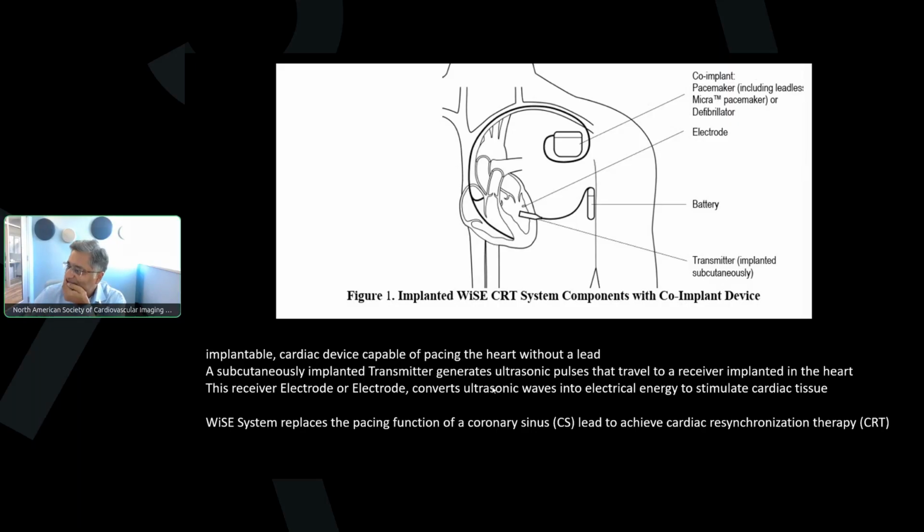Have you guys seen this before, or are you using this? Any experience with this? I've seen just one case so far, so it's interesting that this is the second case I see. I'm not sure how new this is. Yeah, I think that's the key thing, because conventionally we would always say that we shouldn't be seeing leads on the left side of the system, but here we have it. Good thing is that this is mainly for those who have failed.